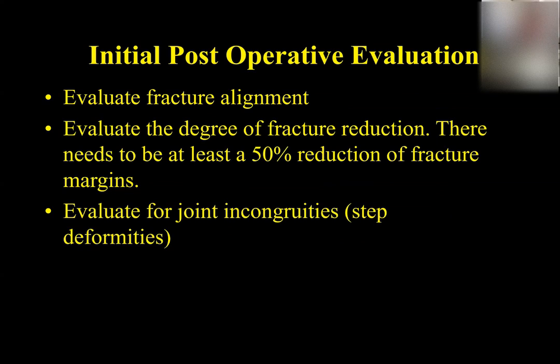You look at some of these things that we already talked about. How well are the fracture fragments aligned? Okay, if they're aligned like this and it's a long bone, that's great. If they're aligned like this, that's not as good. It may still heal, but it's going to take longer to heal.